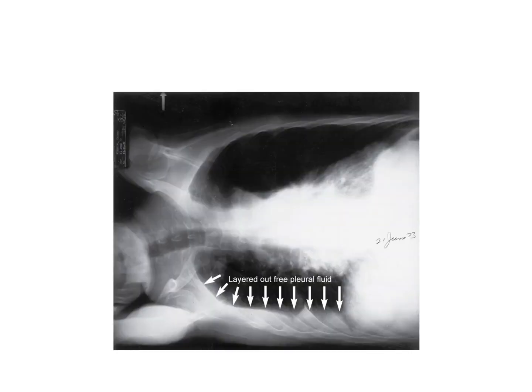Here is one on the lateral film where someone is laying on their, looks like they're laying on their left side. Kind of hard to tell for sure. I think this one is actually in your textbook. Let me look really quick. So this is actually on page 209 in your textbook.